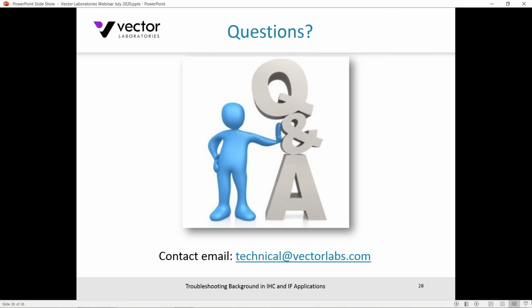Okay, great. The next question, are some tissues more problematic than others for background problems? Yes, they are, and that may depend a little bit on the application you're working with. Certainly mammalian tissues such as kidney and liver do tend to sequester detectable levels of biotin in large amounts. So if you are working with an avidin biotin-based detection methodology, they are particularly problematic. You could certainly avoid those by using a polymer-based system.